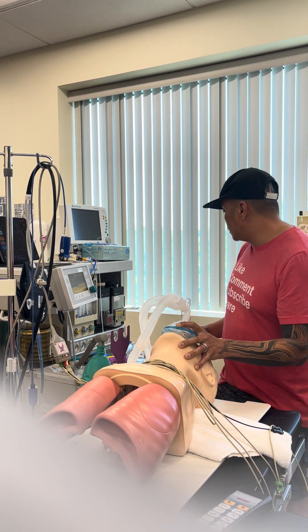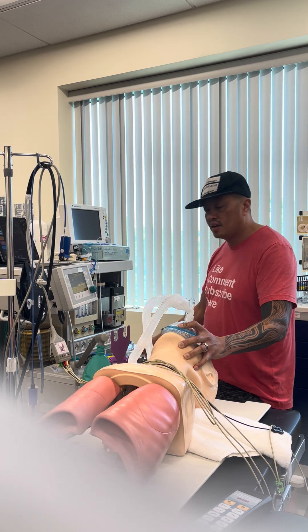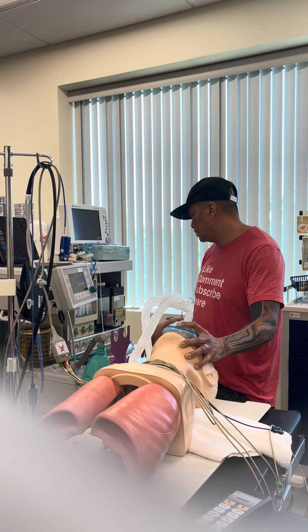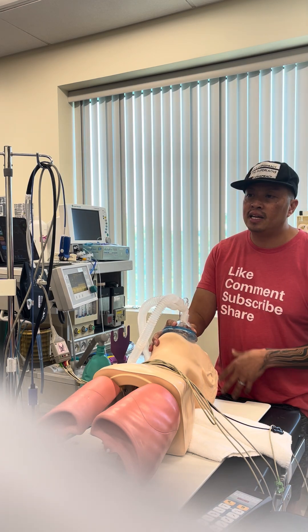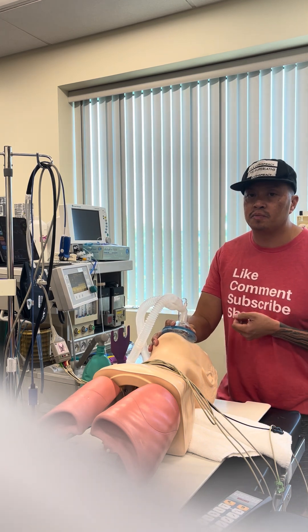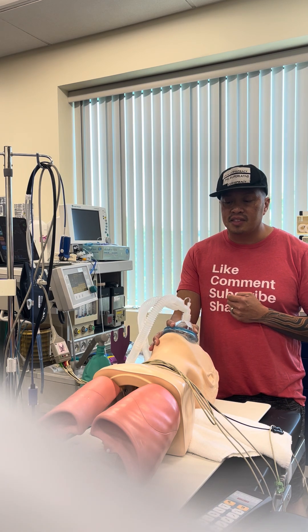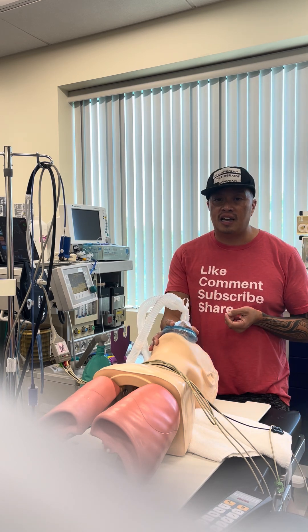So what I'm going to do is bring in some fentanyl and lidocaine. I gave him the fentanyl — 'These medications are going to make sure that you don't feel any pain during your surgery.' And while that's sitting through, I'm going to step back and say: let's do an anesthesia timeout. My name is Howie. I'm going to be taking care of Mr. Joe Smith — a 22-year-old male, full code, no known allergies, no previous medical or anesthetic history. He is here for a lap chole. Does anybody have any questions or concerns? If not, we'll continue to proceed.